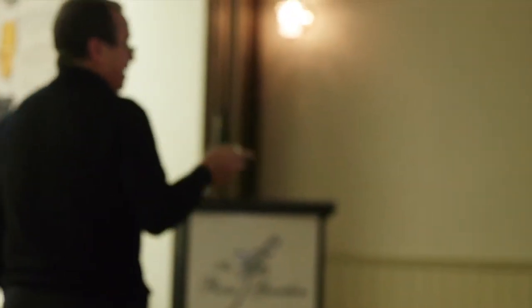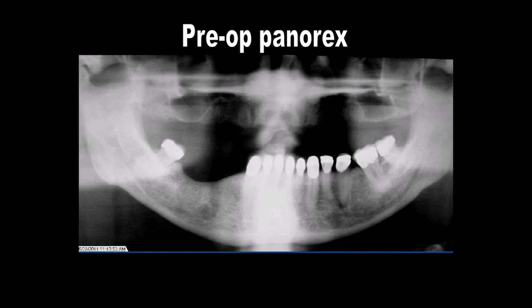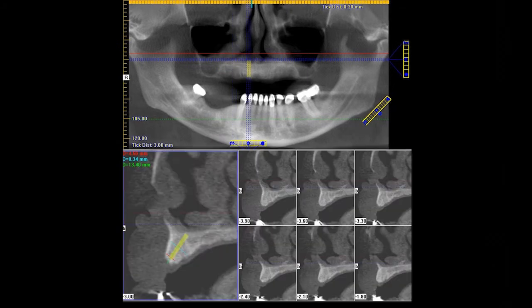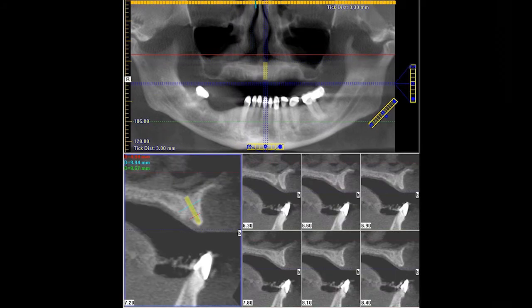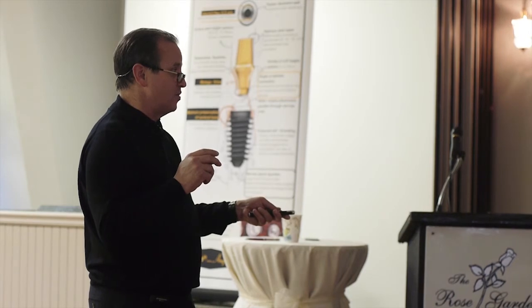And next, this is a pre-op Panorex on a patient that has a beer distributorship in New Iberia. I don't know why I remember that, but I just remember that about him. So here we're going through the CT scan. We're looking at the amount of bone width, upper right quadrant, upper right center, left, left. So he's got good bone width and so forth.